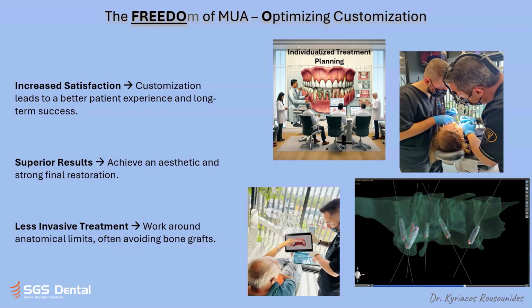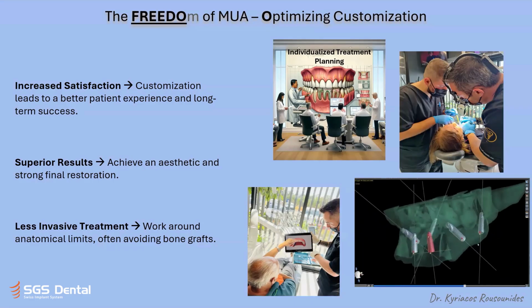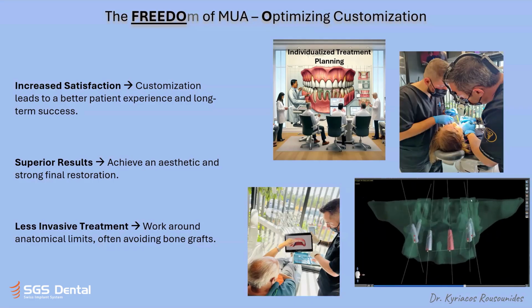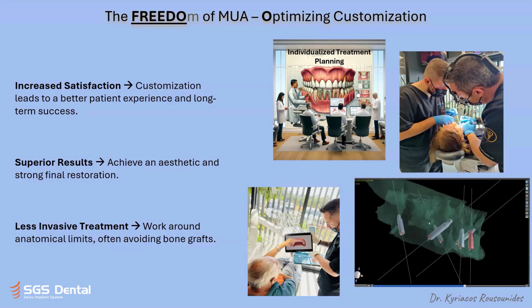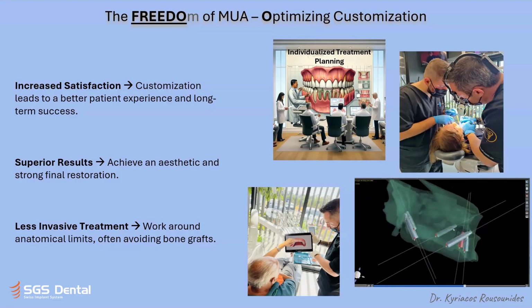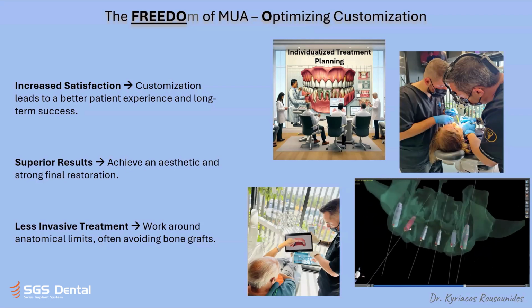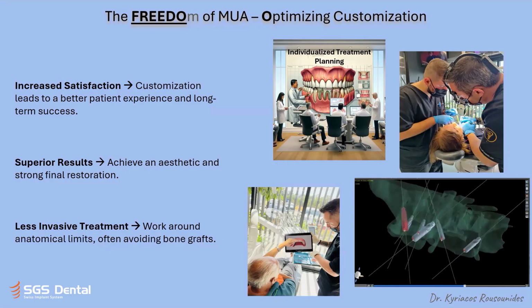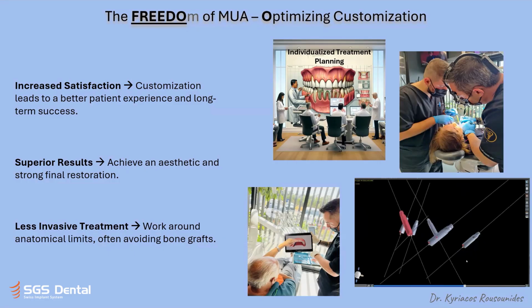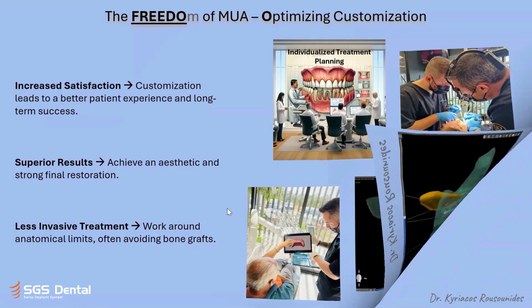Although we use more parts, MUAs, as you know, they also cost. But if you avoid a sinus lift and the second operation, or the augmentation materials, the membranes, and all of this, and with just inserting 2 implants with multi-units, then you can surely be more cost effective.